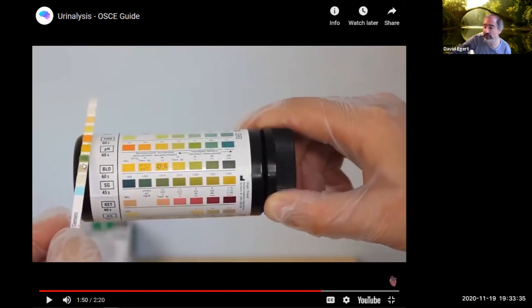Again, we can see the specific gravity is around here. It looks fine. No blood, because this square would have green on it if he had blood in his urine. The pH is kind of acidic, more down here around 6 because it's this brighter orange. So you just compare the color on the dipstick to the color on this key, and that lets you know what the value is for each of these different things we've been talking about.